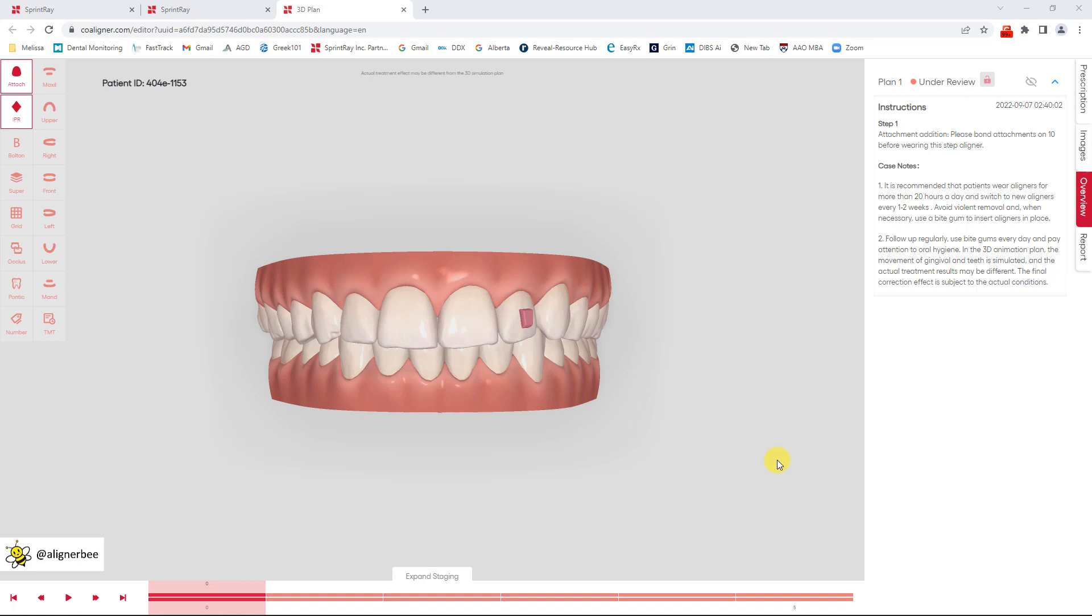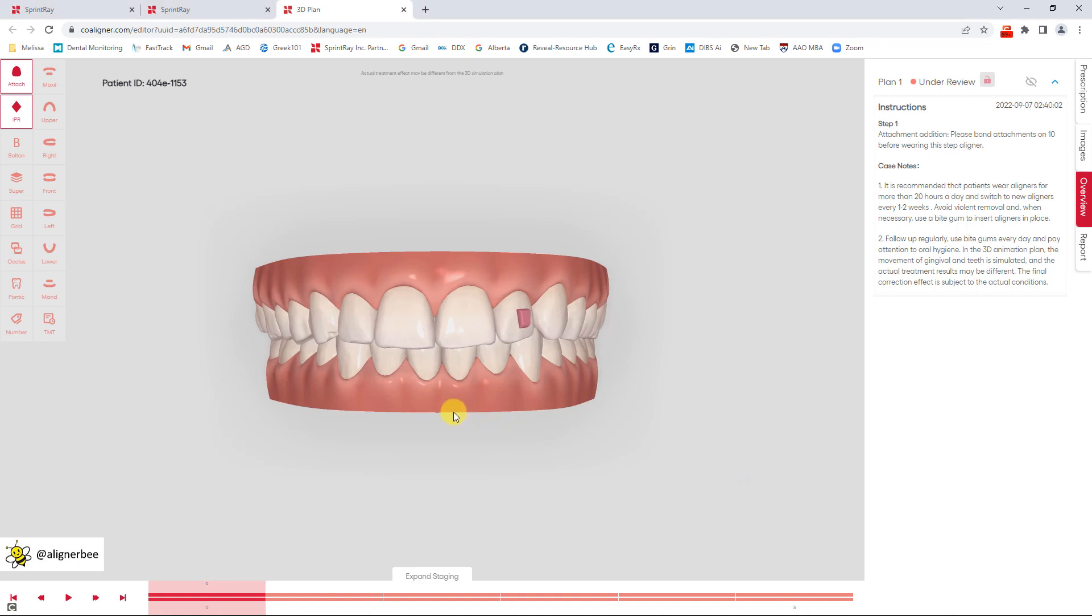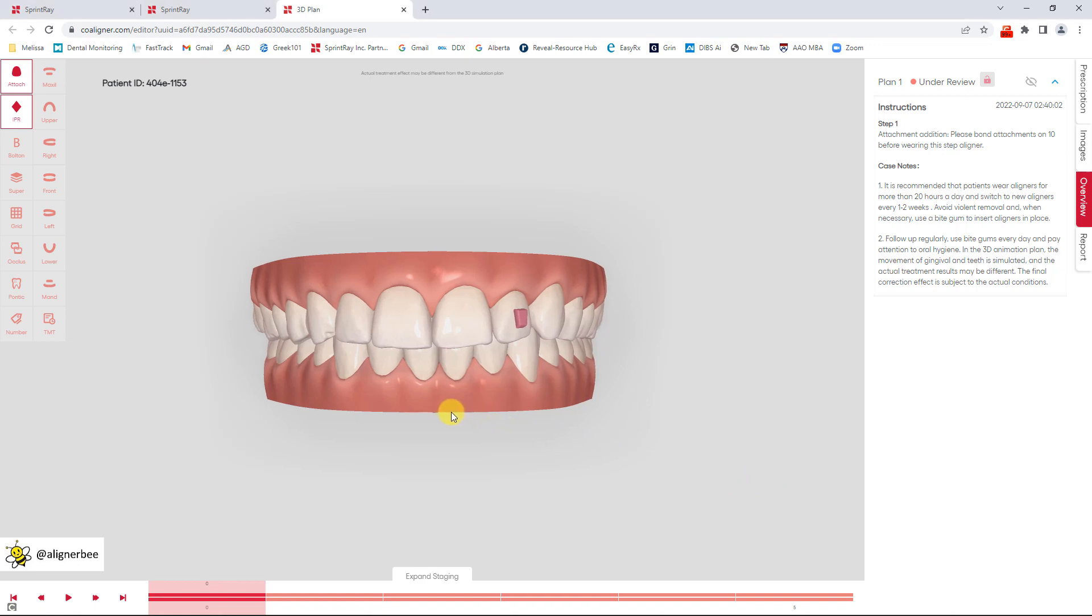Now with the SprintRay smile correction it is for smaller tooth movements and it's not intended to change occlusion. So this is an adult patient where I was treating her strictly for some of her cosmetic concerns.